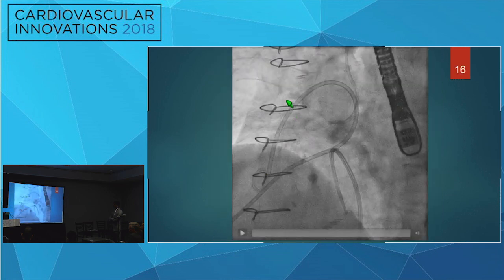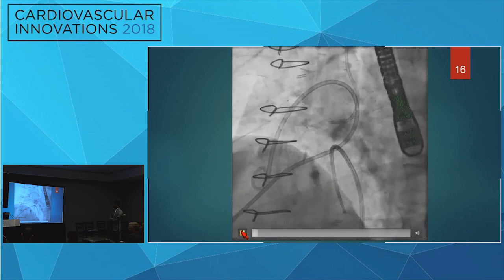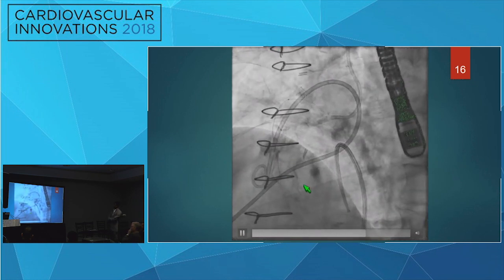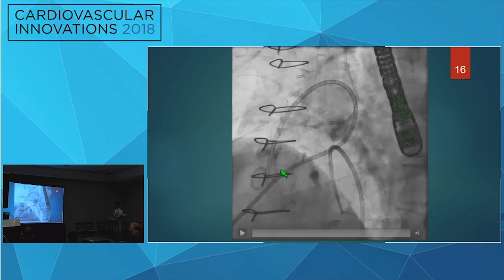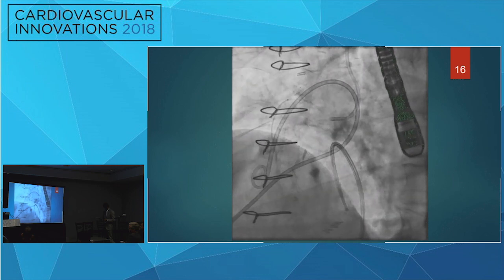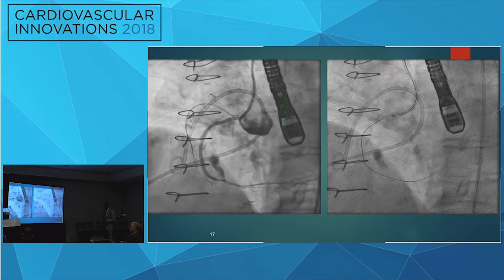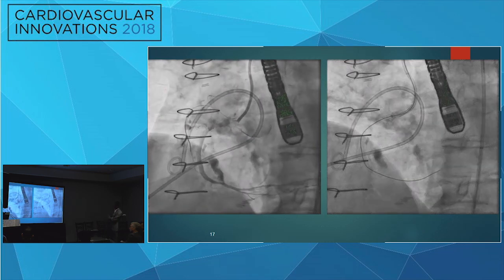So we tried to go with the balloon, just do the same thing there, and once after balloon, we tried to inject, and you still see leaking down there. So we balloon this, we balloon that, and you still see this. So if you occlude one, it obviously increases the pressure on the other, so it increases the flow and causes more accumulation. So it's like increasing the resistance at one point, and then it builds pressure and it leaks more. So obviously we decided to go and fix both at this point. And that's why we got a picture, and you still see the myocardial blush and the perforation down there.